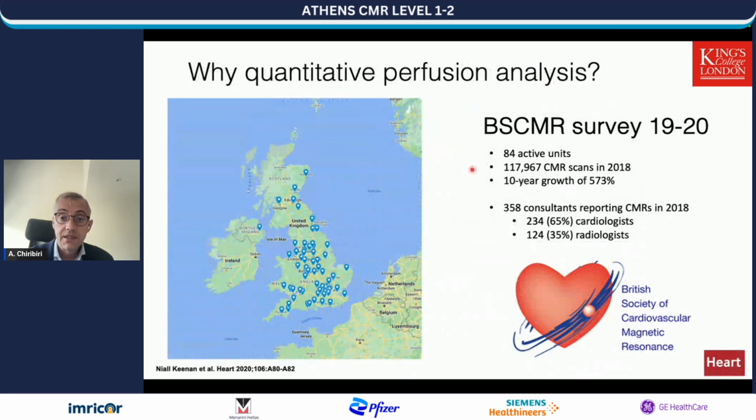Limitation is that, of course, cardiac MR is increasingly used. Scanners are nowadays capable of acquiring cardiac MRI, no matter whether they're installed in cardiology or in radiology, whether they are in a large hospital or in a small diagnostic center. So there is a real need, real demand to increase the number of scans.